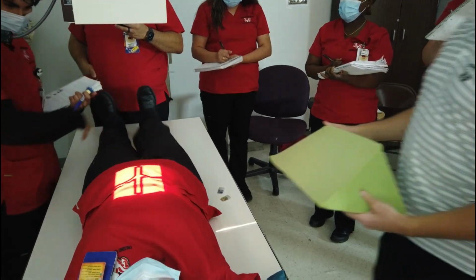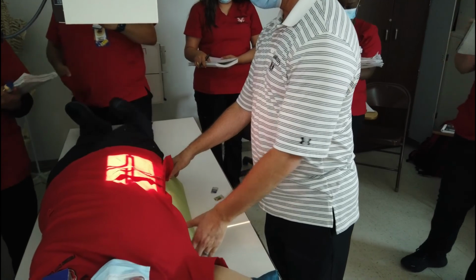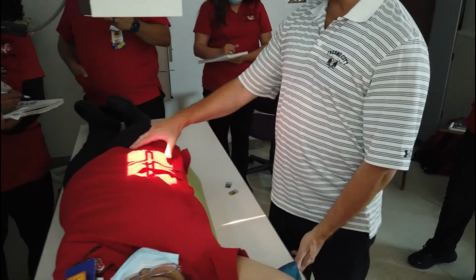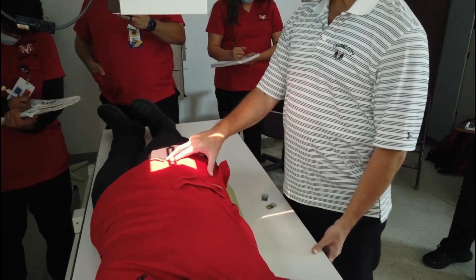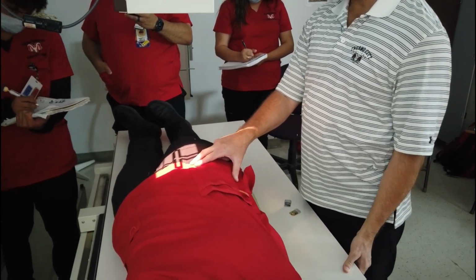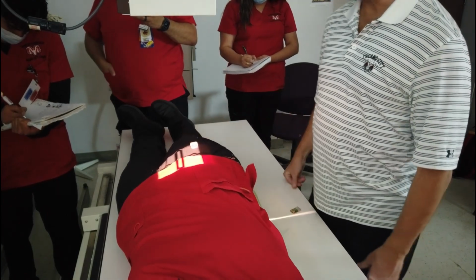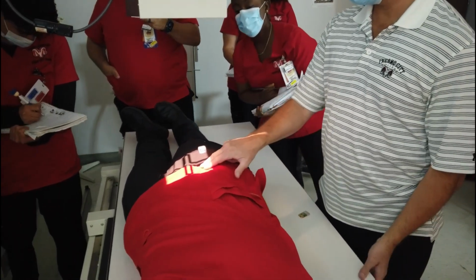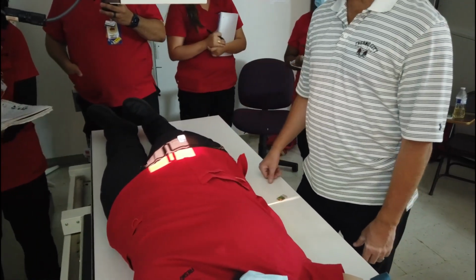Roll away from that. About a 45-degree oblique. Here's the ASIS. We're going to go into and down to. All right, marker. So here's the ASIS. Down now. Into, down to. All right.